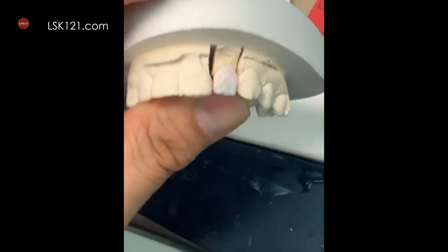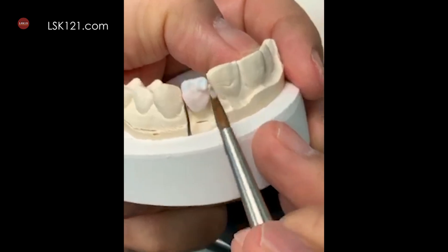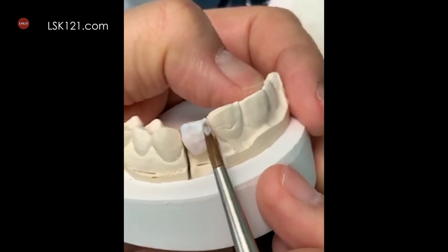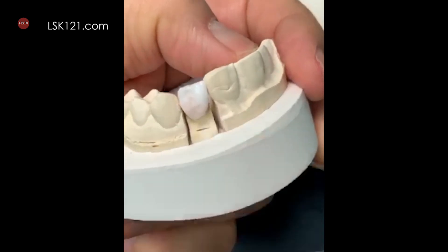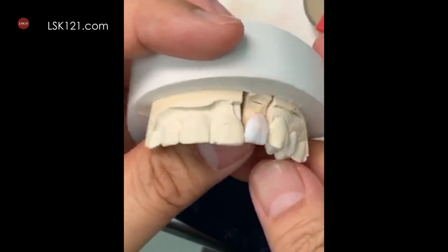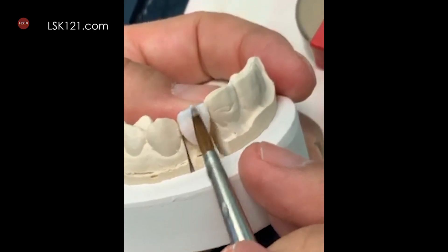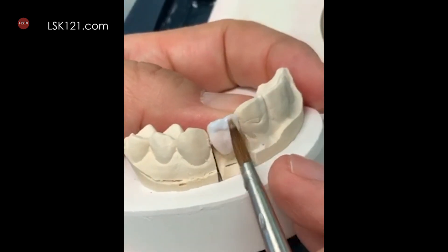I'm using the top of that to see it — it's clear. And then I'm going to control it. Okay, slightly longer is okay.